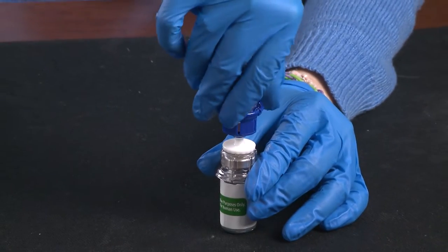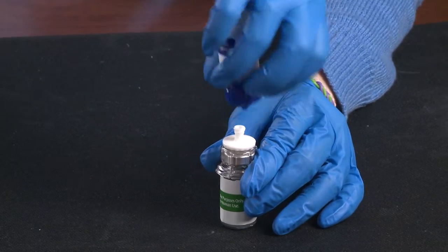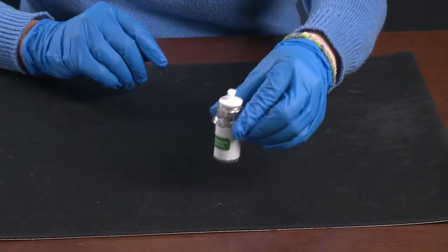When the sterile water is empty, disconnect the two vials. Gently swirl so that all of the powder is dissolved.